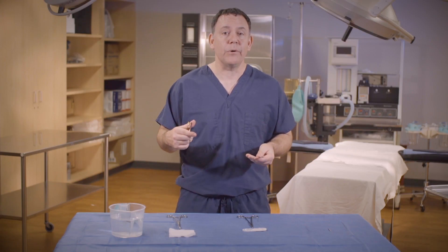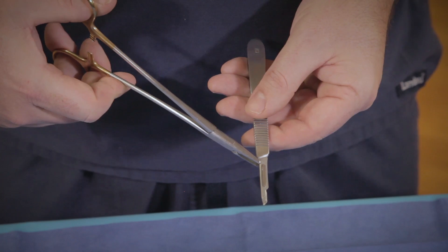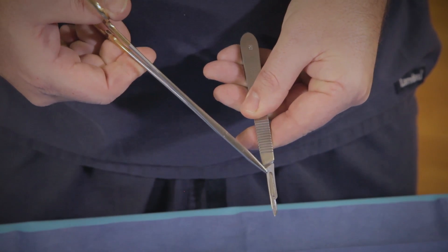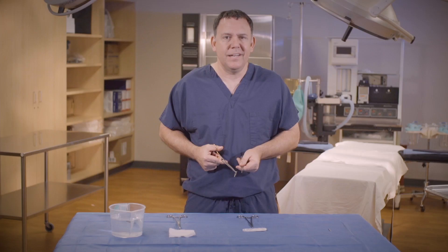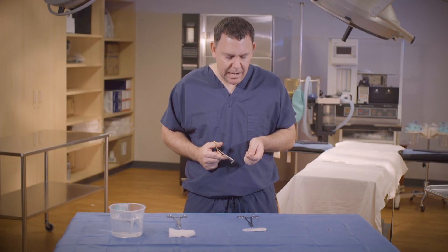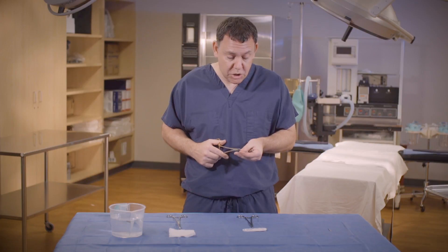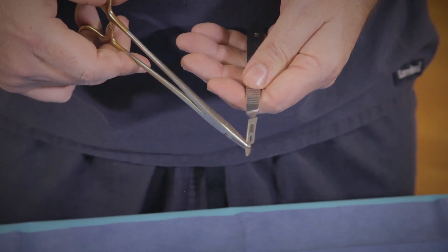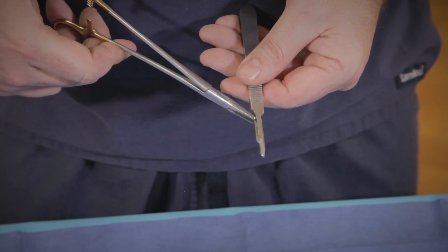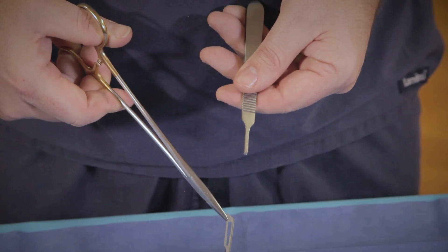Now I'm going to show you how to remove the blade. Pointing the blade down — super important. I'm going to ratchet the blade at the end, slightly lift the blade off the knife handle and push it away. Now sometimes it's easier for students to turn the knife handle upside down because they think they see more of the blade that way. I'm going to go ahead and show you that technique too. I'm going to put the blade back on. From the backside, they can see a little more blade. Ratchet the needle holder onto the knife blade, pull down and that's removed.